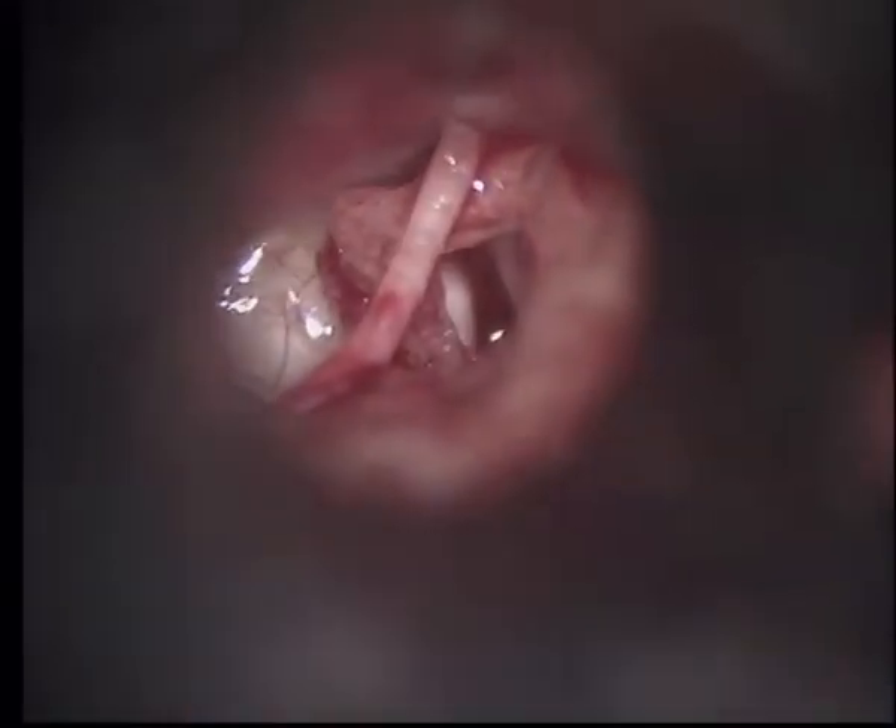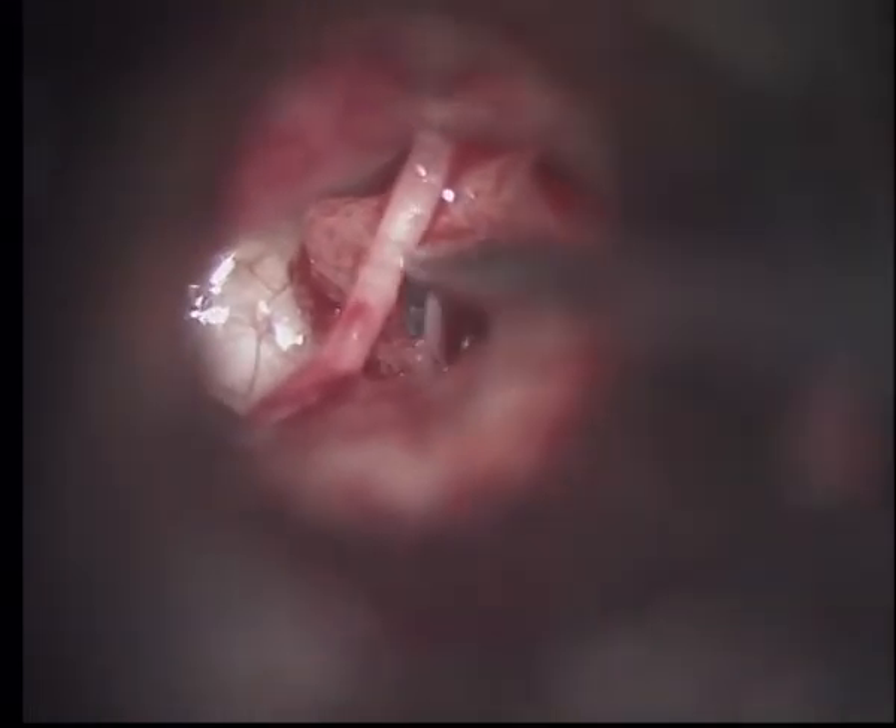The posterior crus was separated, the lower part was separated, and the stapes superstructure was removed. Here we can see the stapes superstructure which has been removed. This stapes superstructure lying in the middle ear was then removed.